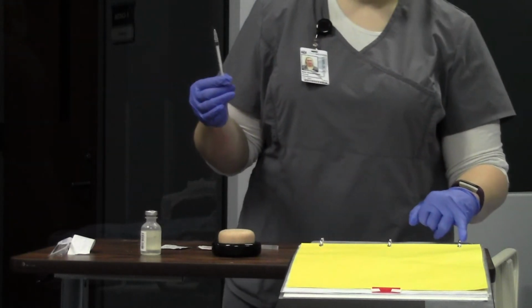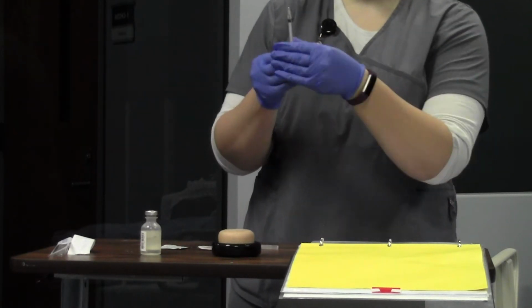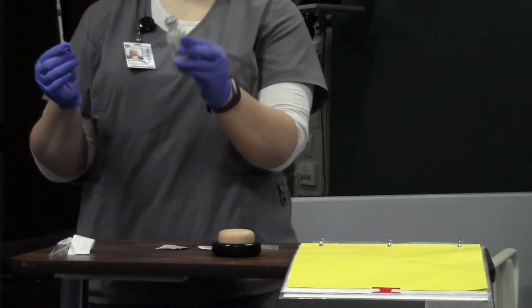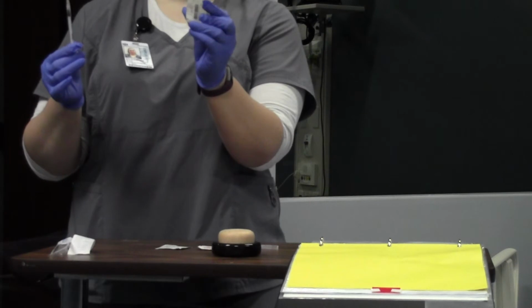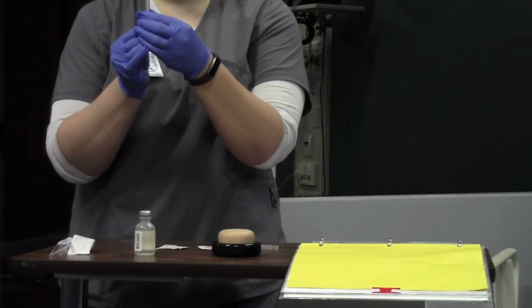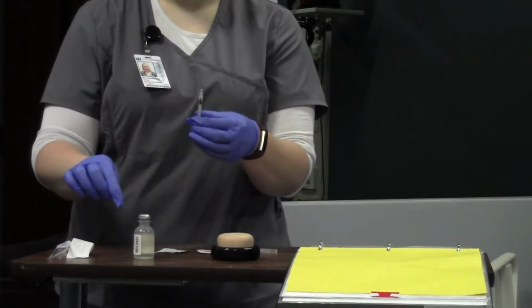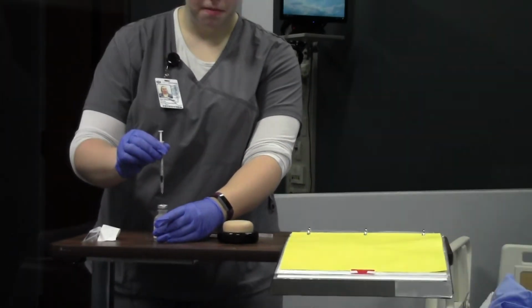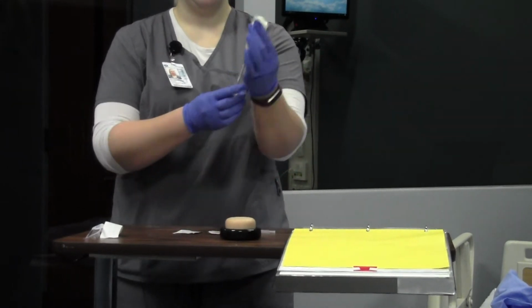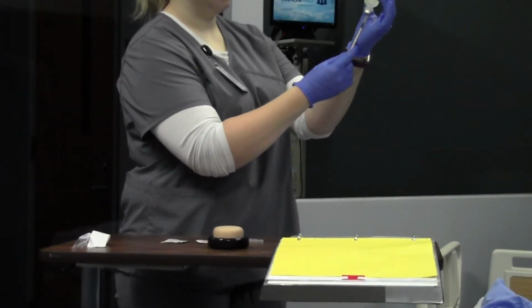And I'm going to check with my MAR. So it says tuberculin solution 0.1. I'm going to check my vial. Tuberculin solution 0.1 is my dose. So I'm going to pull back air to that dose. Make sure my top is still clean. I'm going to inject air, and then I'm going to draw up my solution.